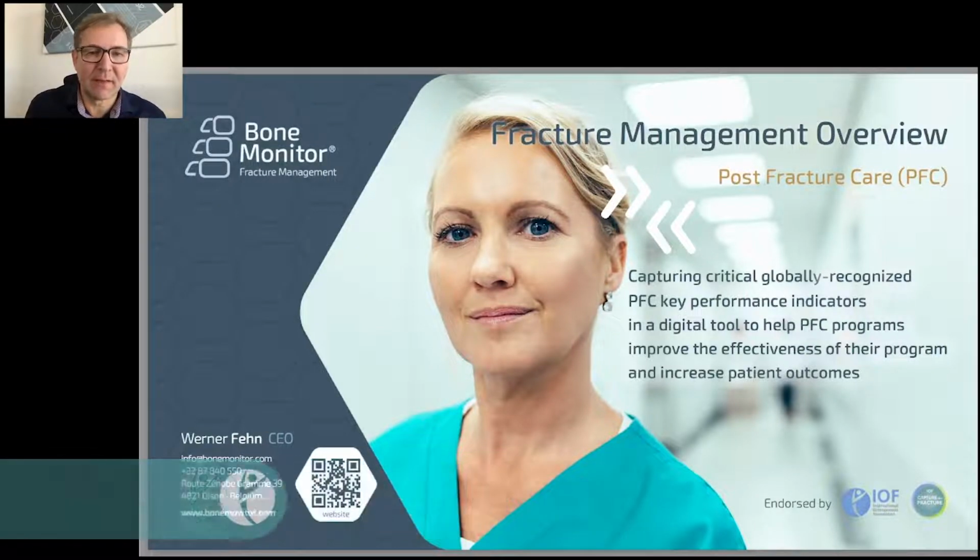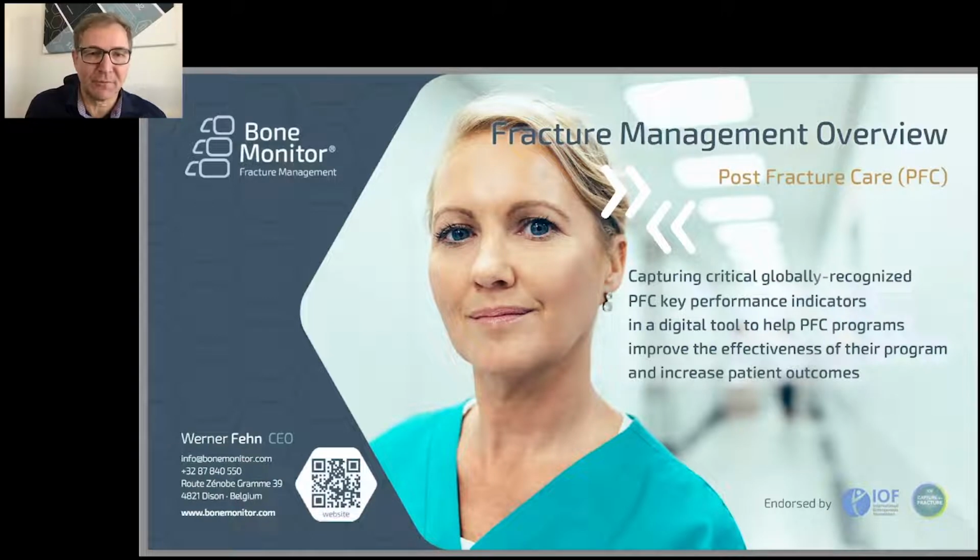We are doing this Lyosis fracture management software to help you in your PFC programs. First of all, I want to show you a very few slides and then I'm happy to give you a live demo of the software. So let's start.